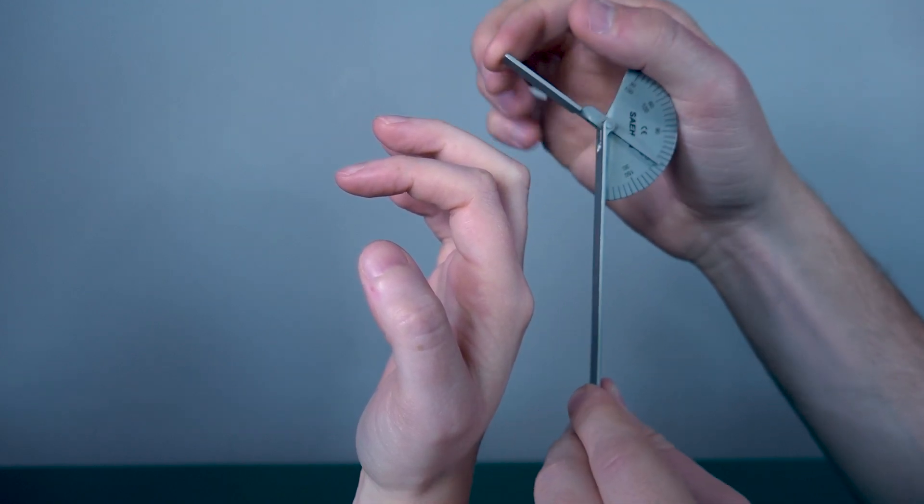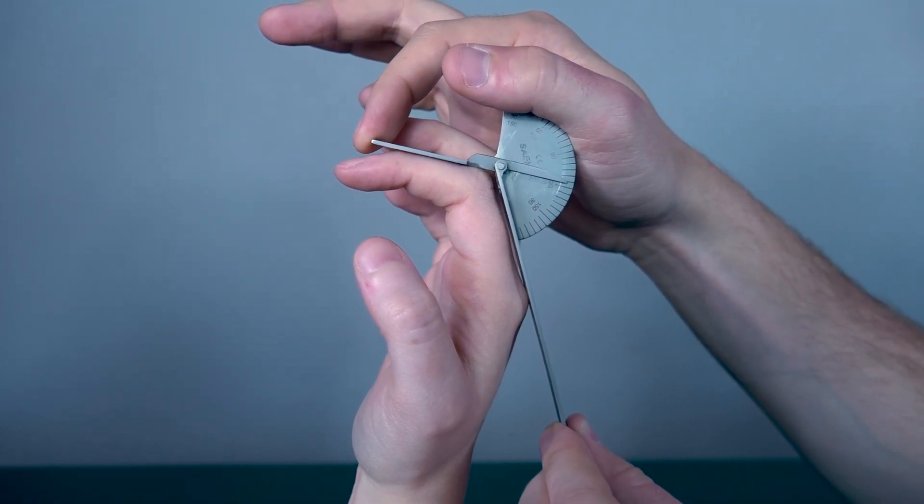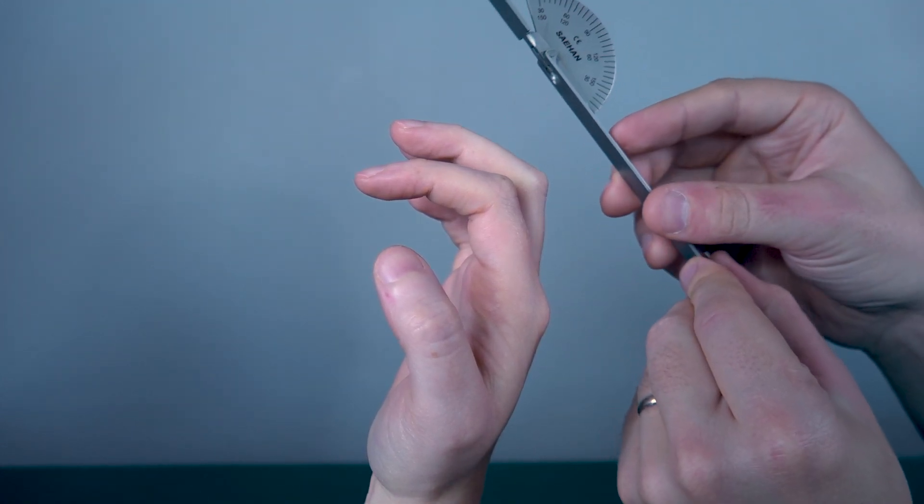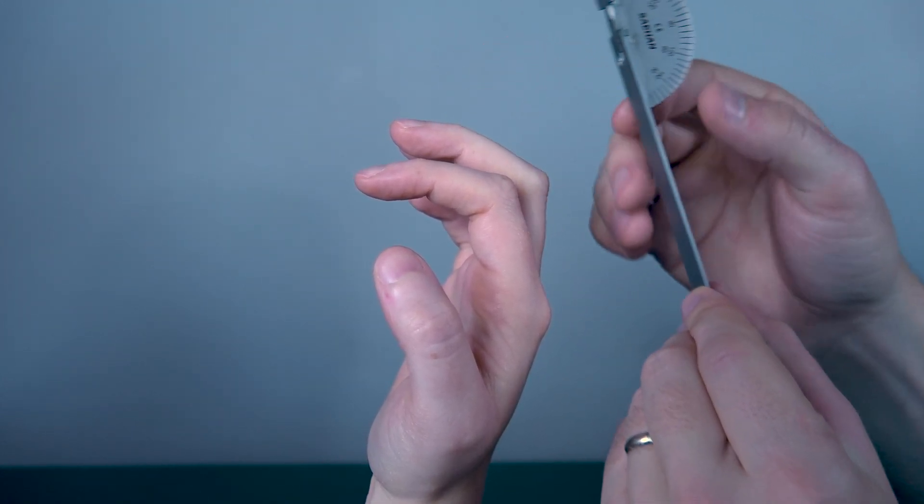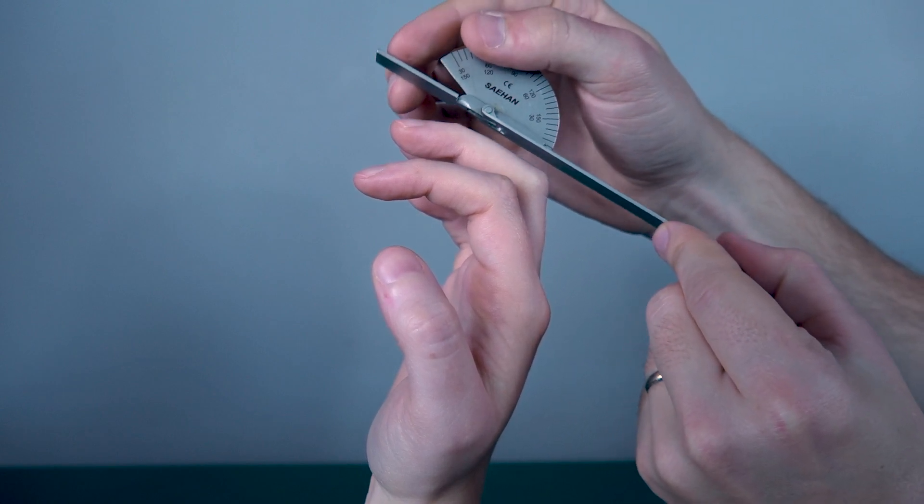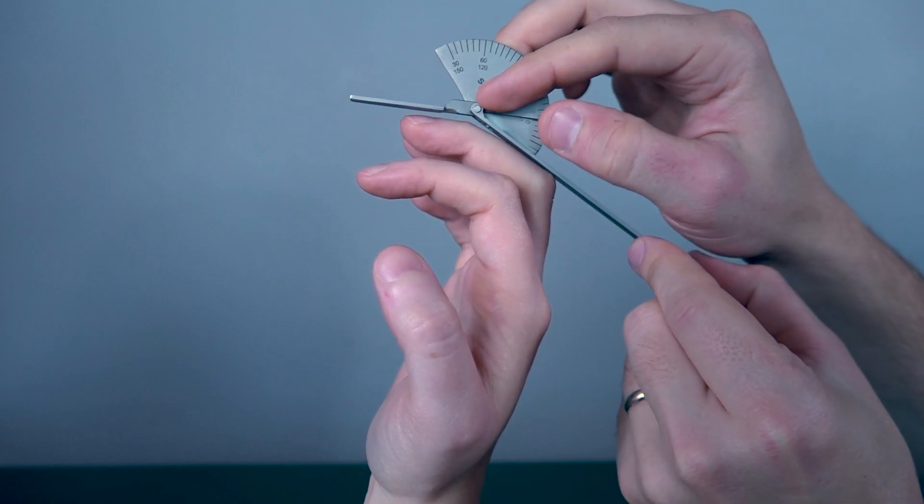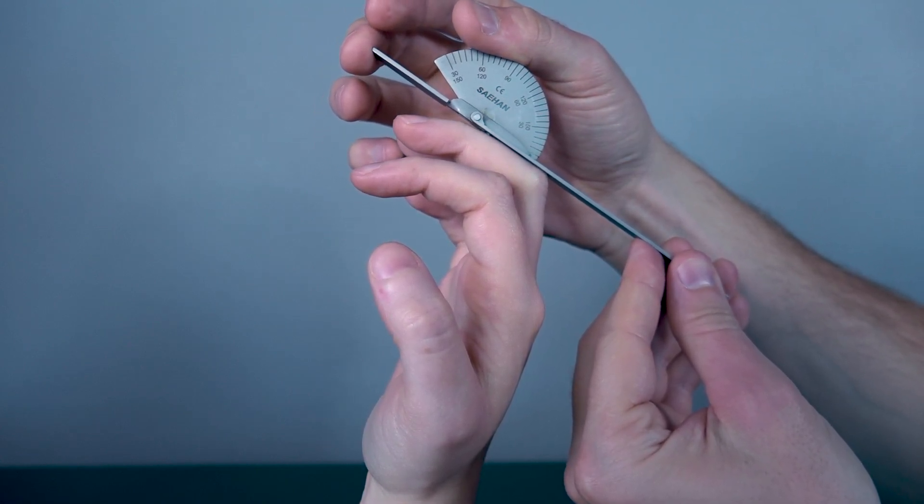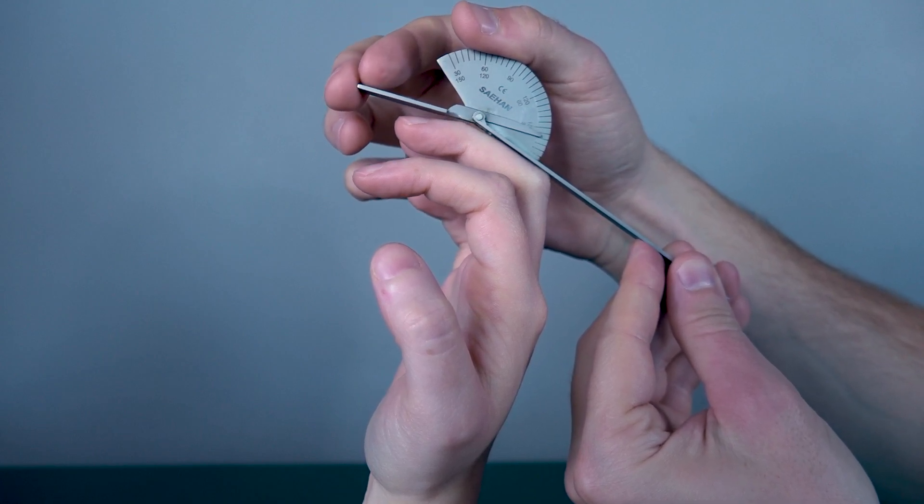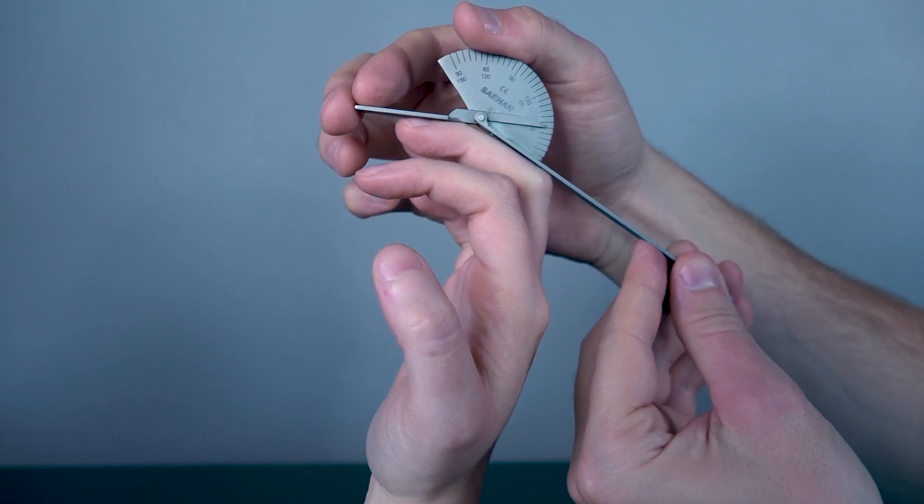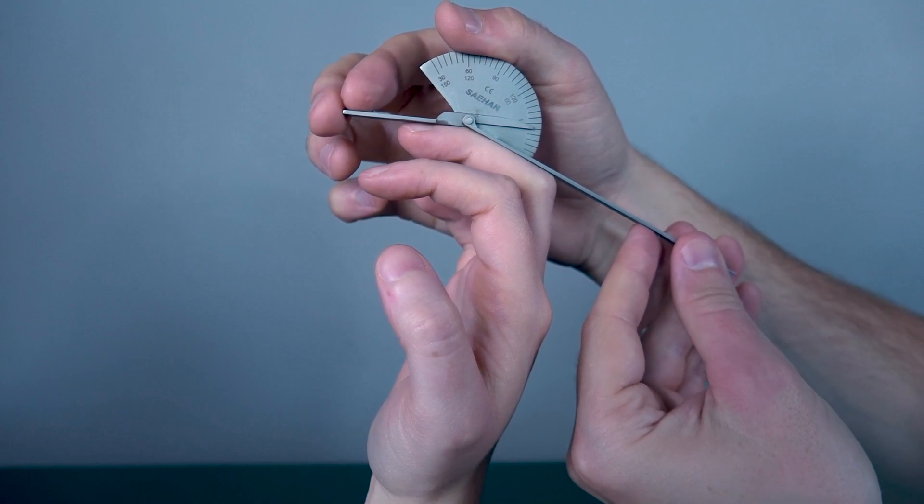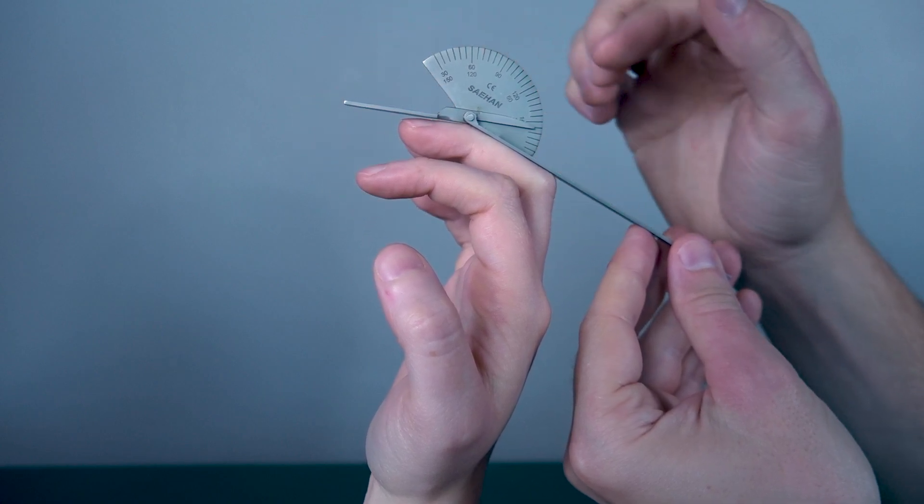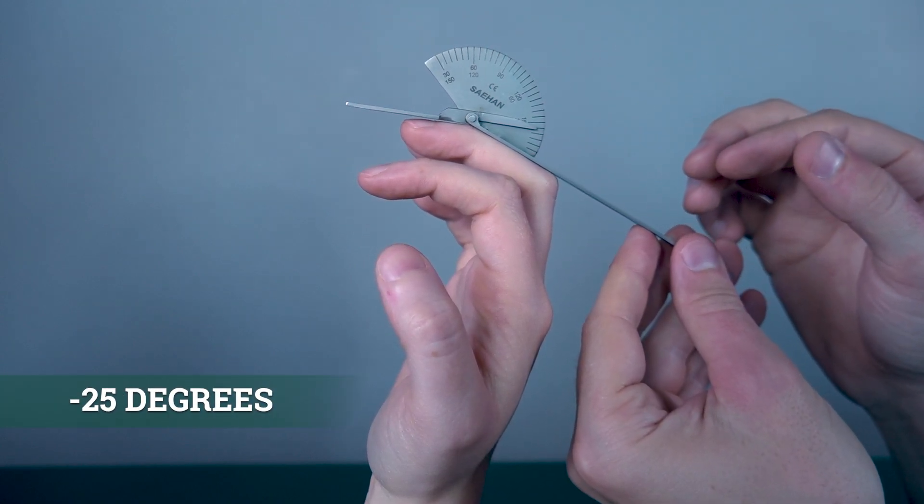You will do that for all of her PIP joints to test for extension. Same thing for the DIP, except instead of putting it on the proximal, we put it on the middle and the distal. Middle, distal, axis on the DIP. We want to see how much she's lacking. It's supposed to be up here but it's down here instead, so we're looking at about 25 degrees she's lacking of extension. That would be considered negative 25 degrees of extension.